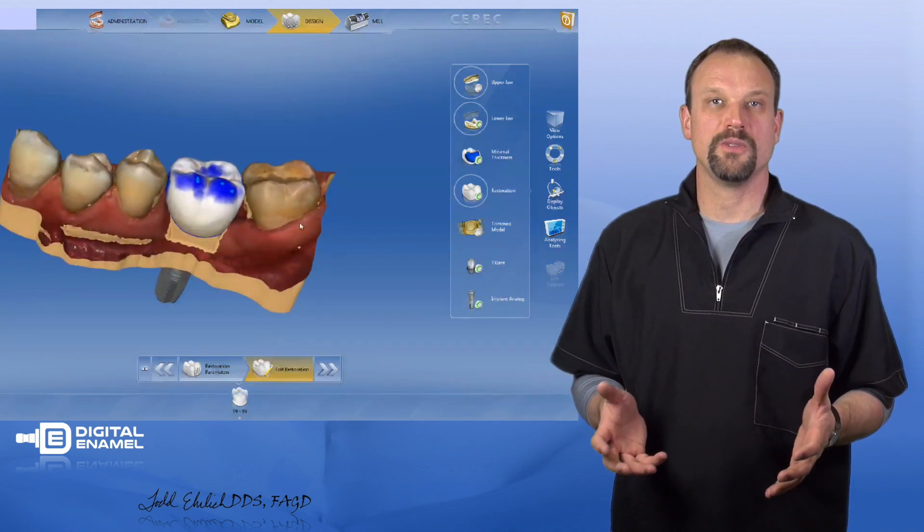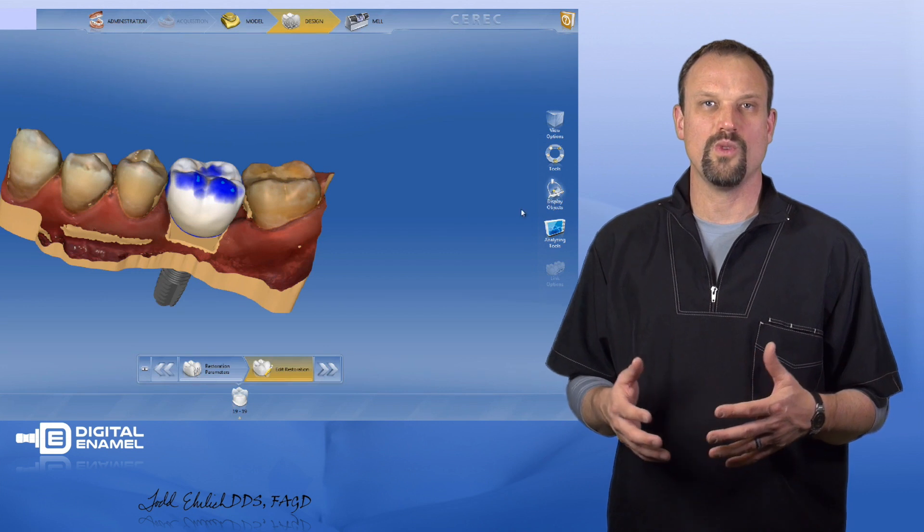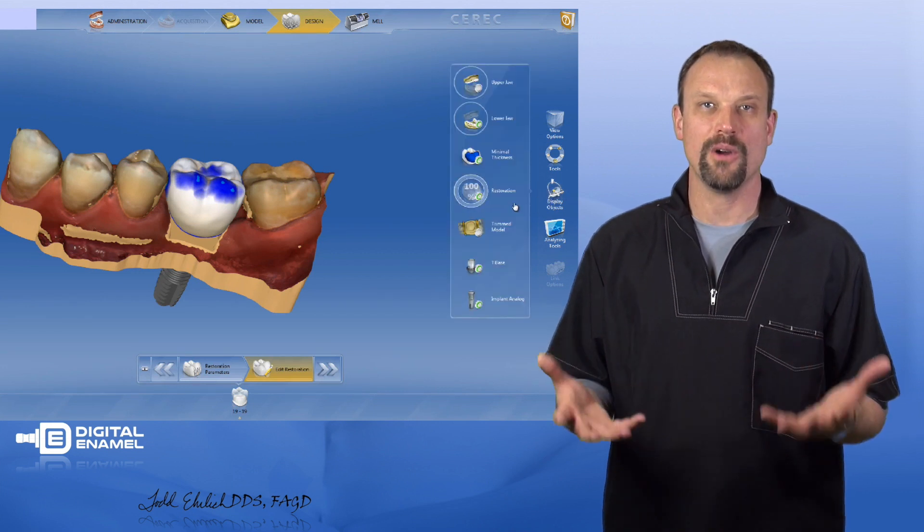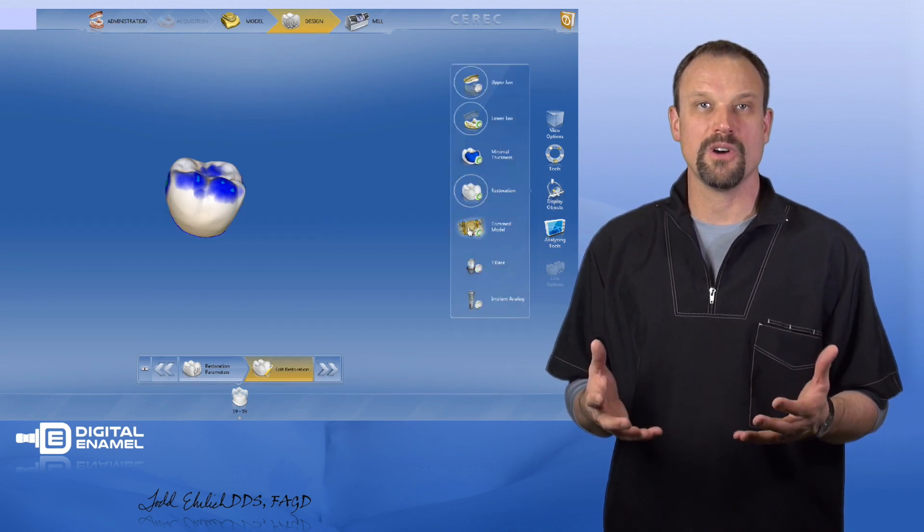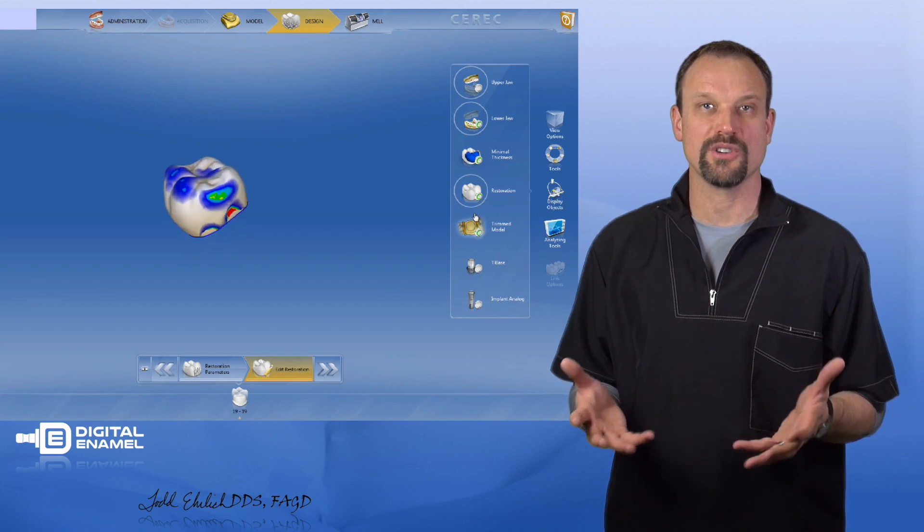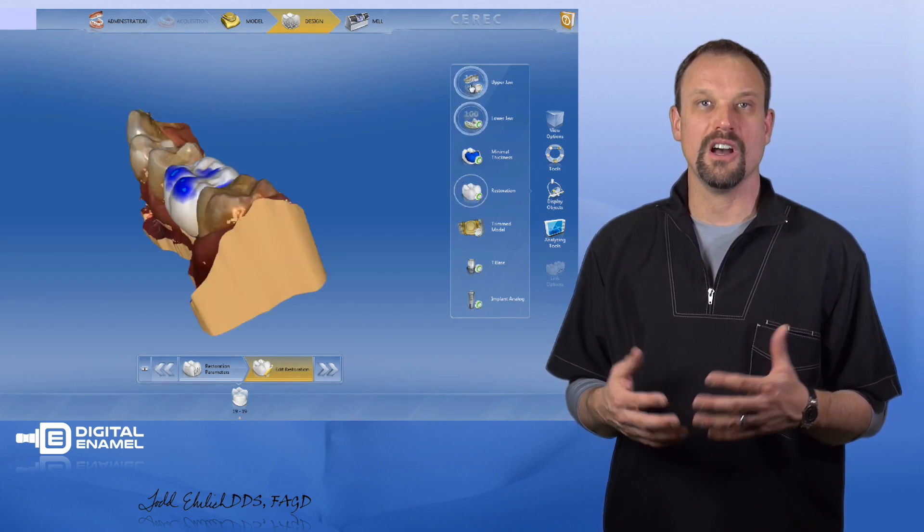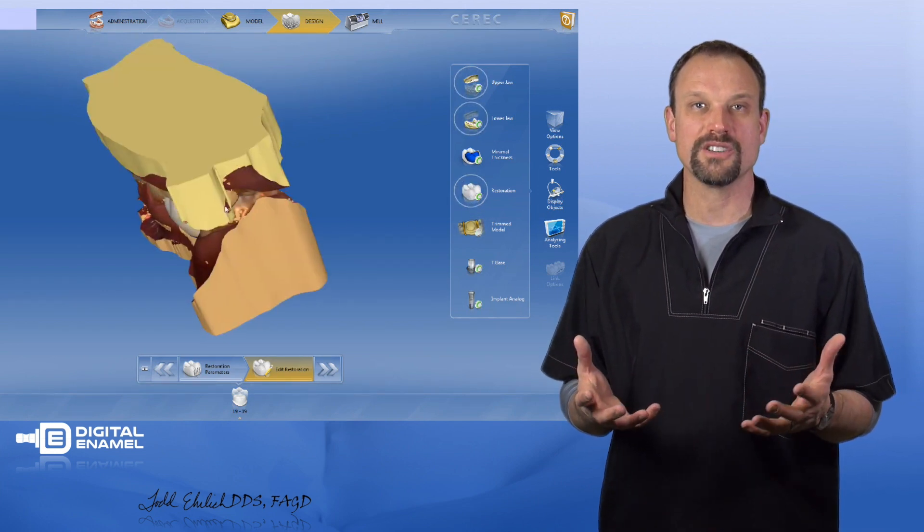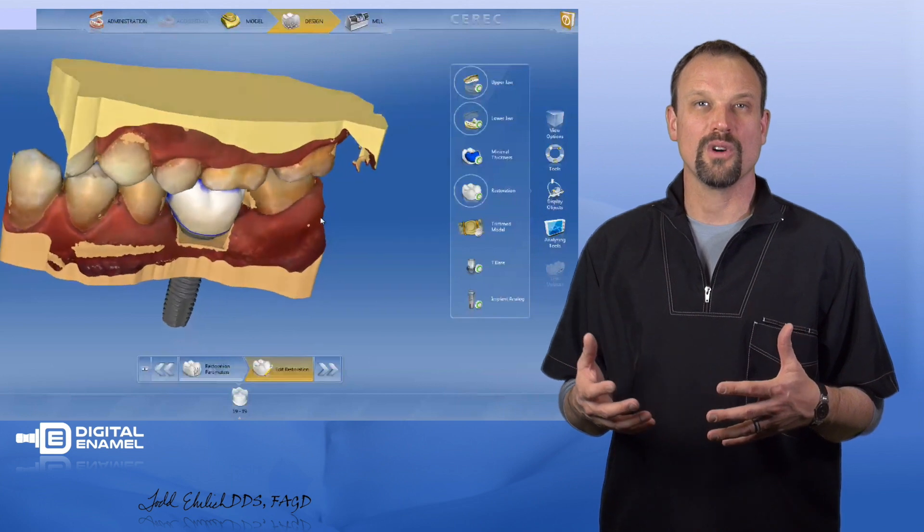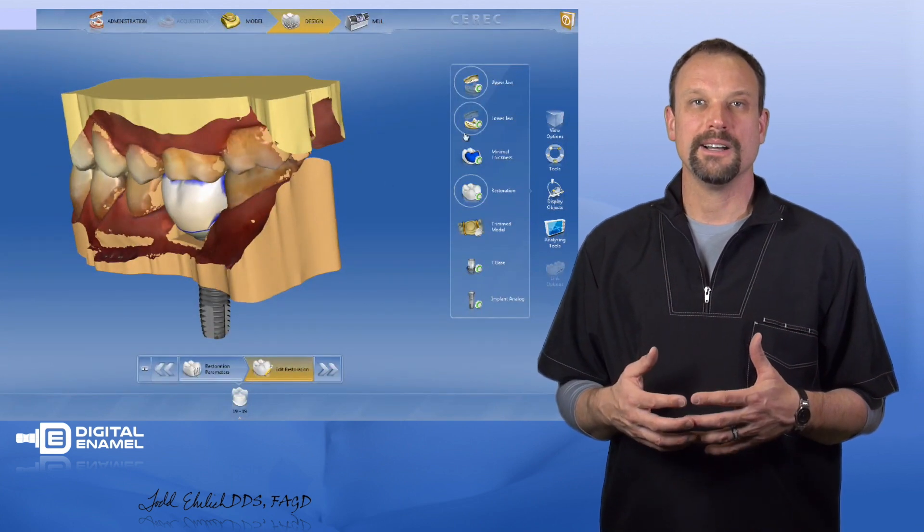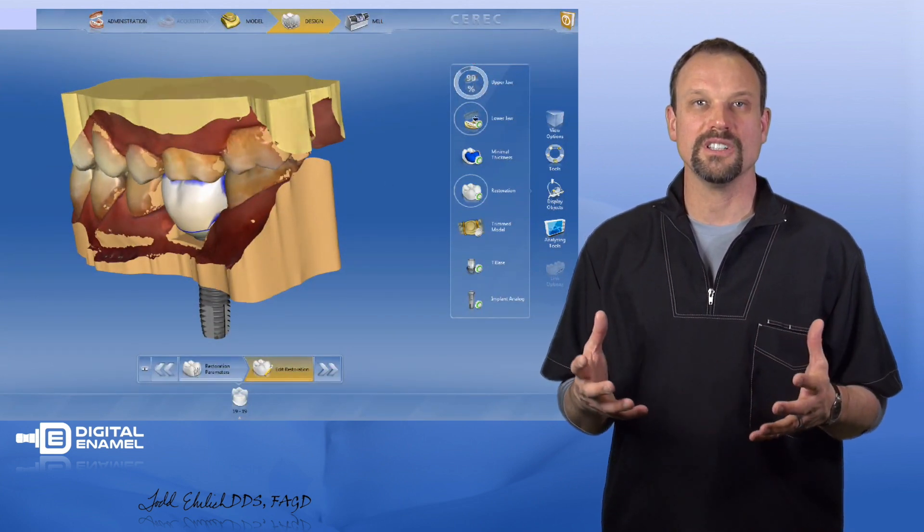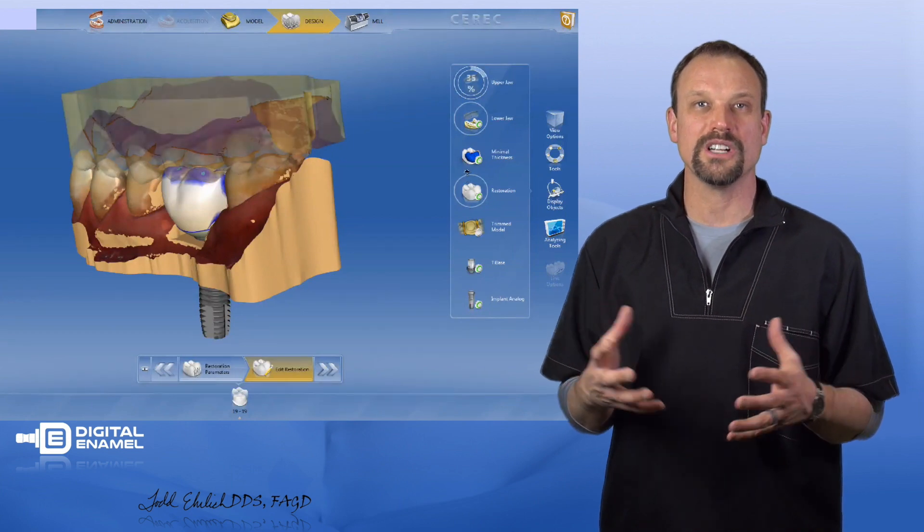Another button is called display objects. This is basically how you tell CEREC how you want to look at this. Do you want to look at the models trimmed? Then you click trim models. Do you want to look at the upper model articulated with the lower model or a preoperative model? Do you want to make a model translucent or do you want to make the restoration translucent?